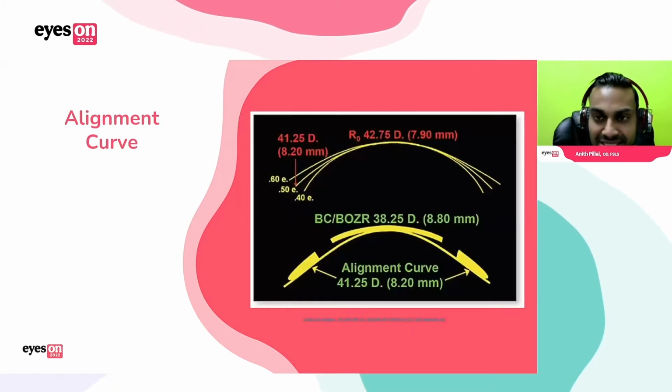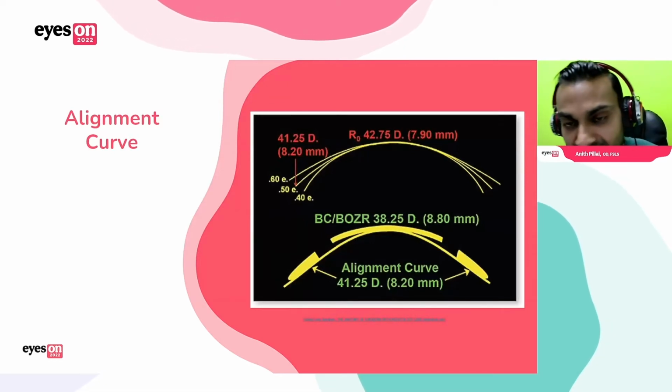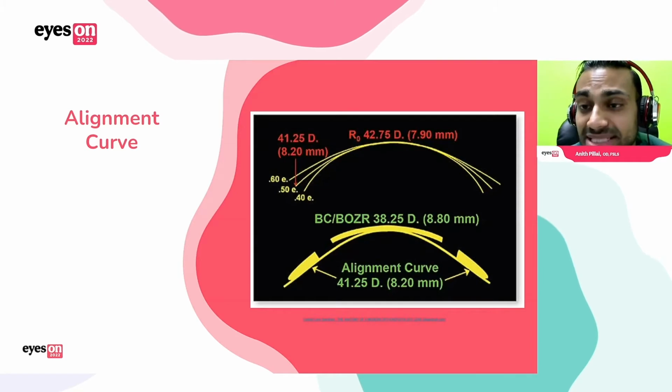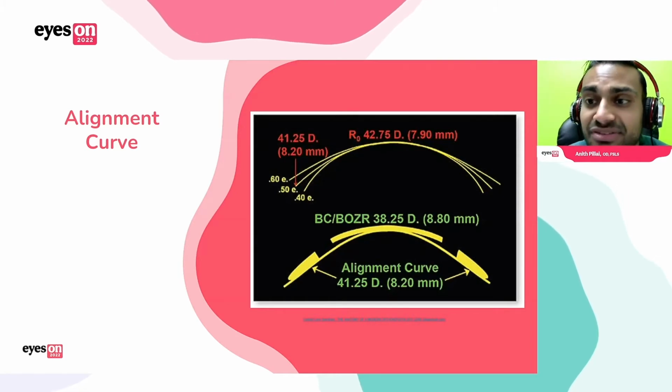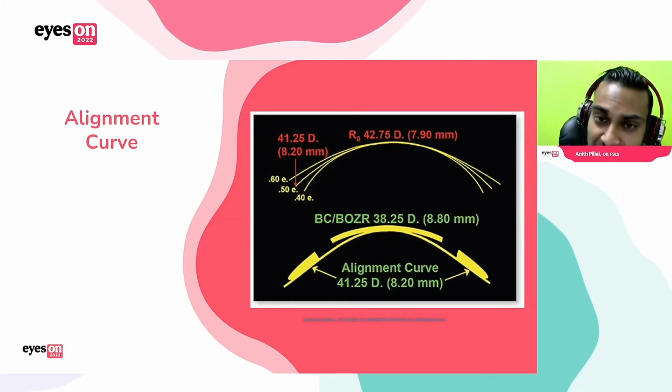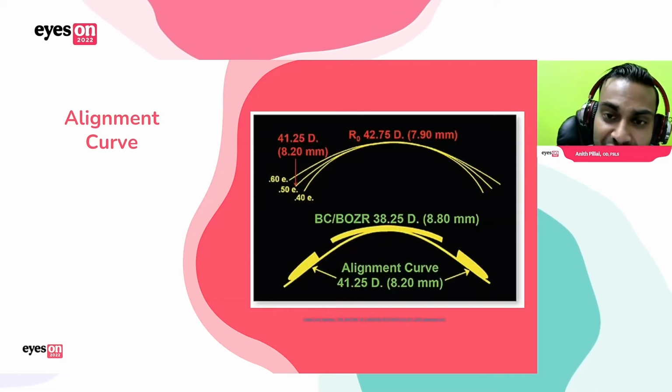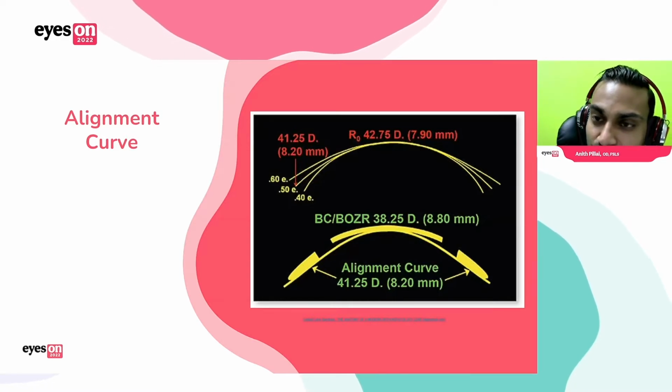So eccentricity is sometimes confused because of how the numbers are depicted. So again, it's the rate of flattening. How much is it flattening from that central area? And if you look at this top image, you'll see that that 0.6, that first curve, is a bit flatter than 0.5 and 0.4.